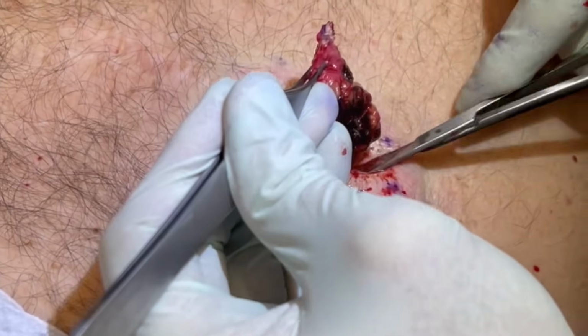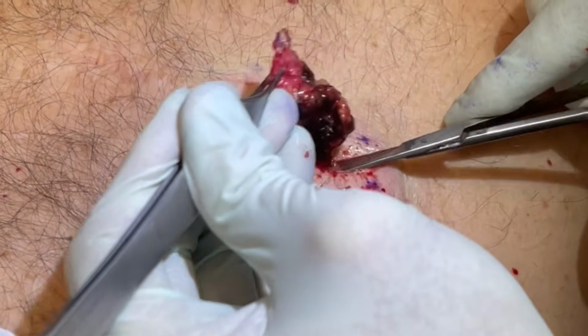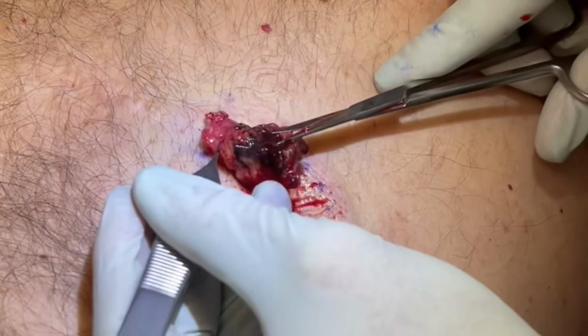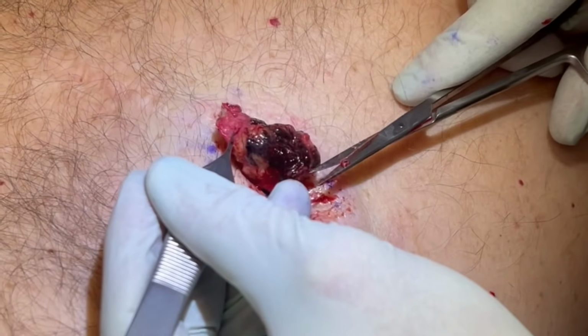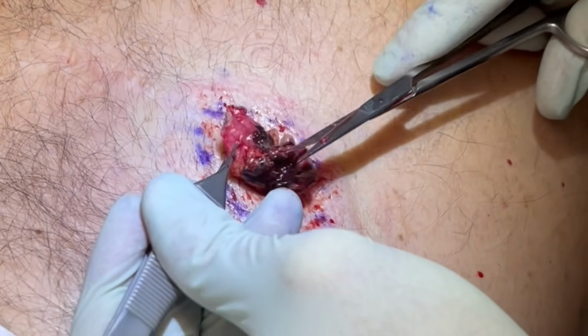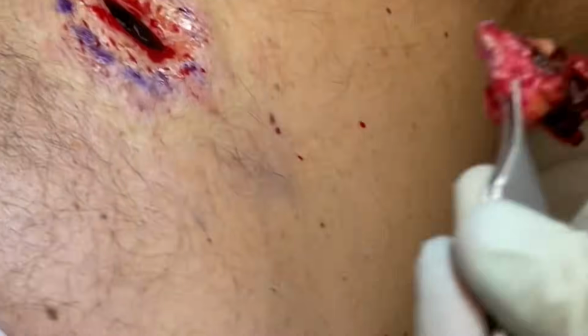You've never had a history of melanoma or anything like that? I had, I think, a melanoma on my leg. Okay. You had a melanoma how many years ago? Can't give you a number. It's been a while? Yeah, been many years. Okay. We'll dab in there.